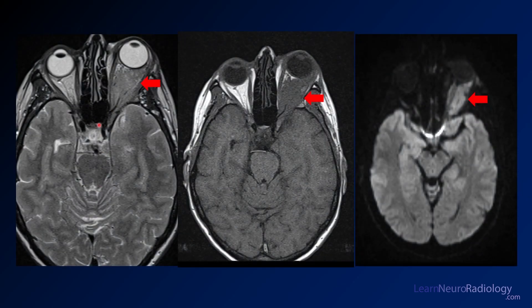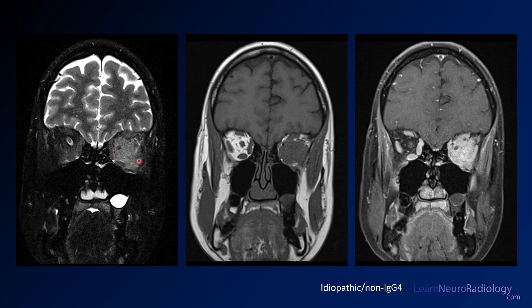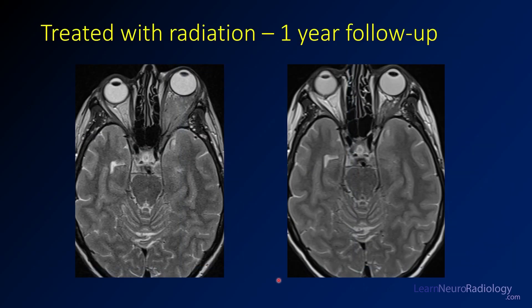Reviewing the MRI findings: T2 intermediate material in the orbit, replacement of orbital fat by T1 iso-intense material, abnormal diffusion, T2 abnormality on fat saturation, and avid enhancement. This case was non-IgG4-related disease, but the appearance is similar. The patient was treated with radiation, and at one-year follow-up the orbital fat has returned, mass effect improved, and proptosis resolved.